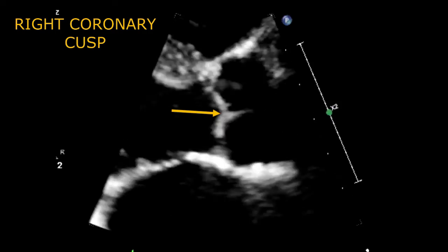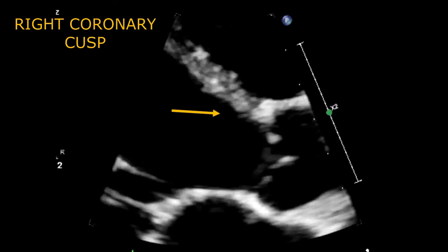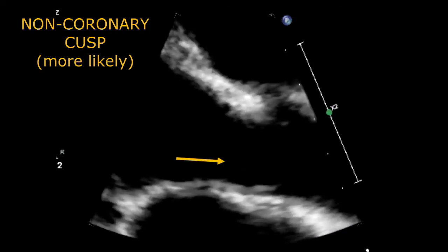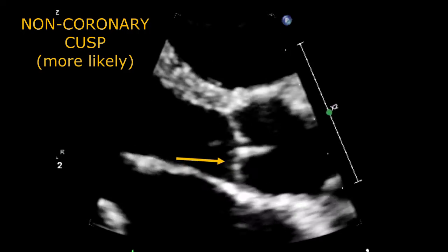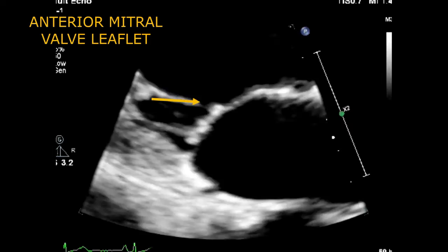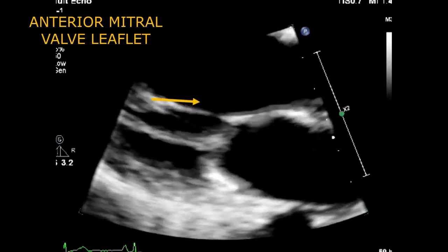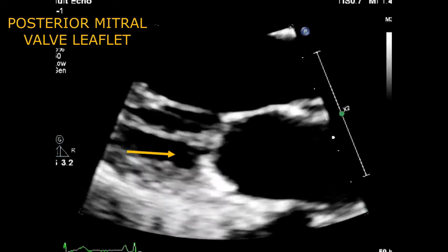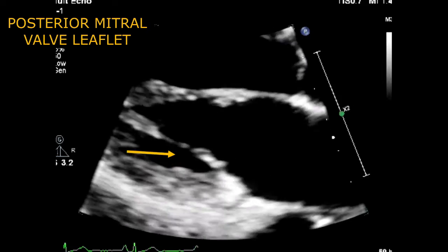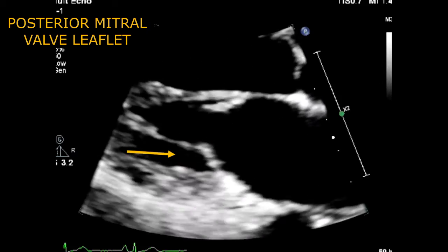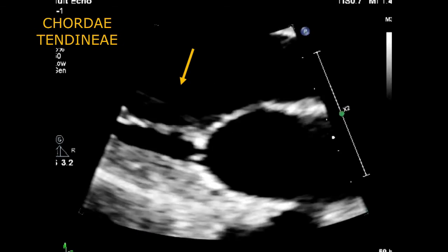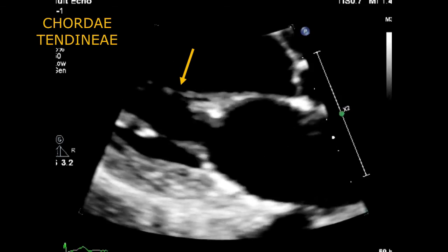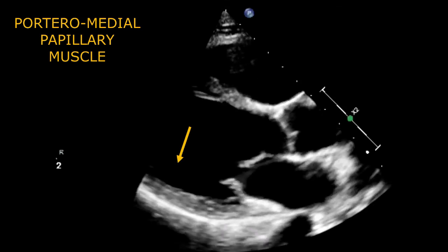Right coronary cusp. More likely the non-coronary cusp. Anterior mitral valve leaflet. Posterior mitral valve leaflet. Chordae tendineae. Posteromedial papillary muscle.